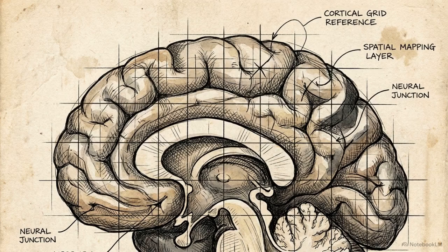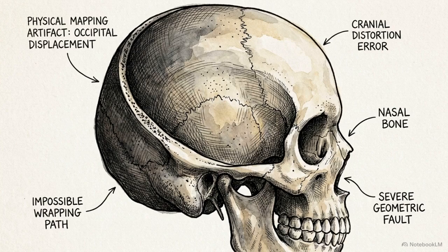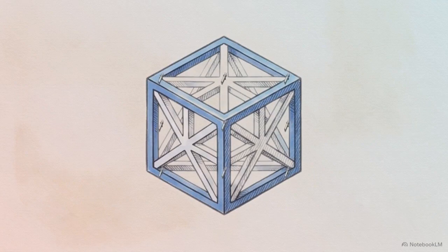Constructing this invisible mathematical matrix is what makes MRI possible. Knowing exactly how it's built is the only way to read the resulting image accurately and recognize when the physics of the machine create visual errors. In uniform magnetic fields, protons spin identically. To isolate the z-axis, we apply a magnetic gradient, stronger at the head, weaker at the toes. Now, each horizontal slice spins at a unique frequency.